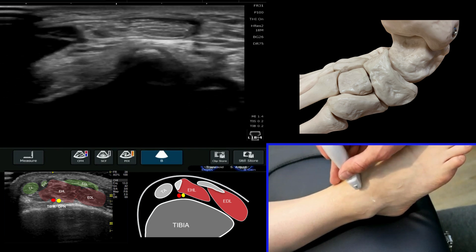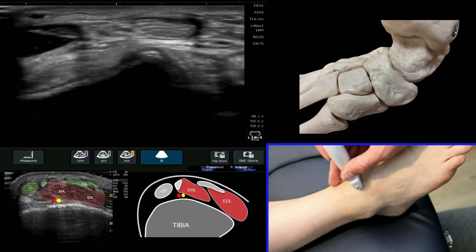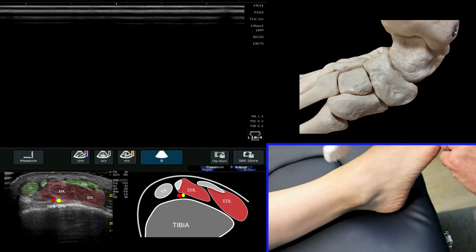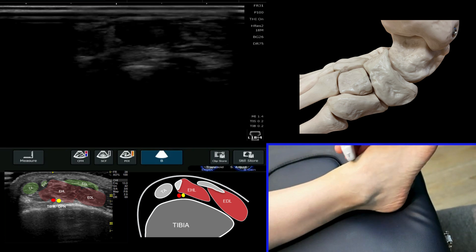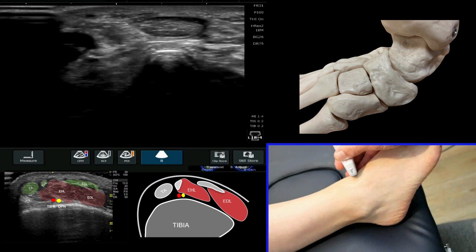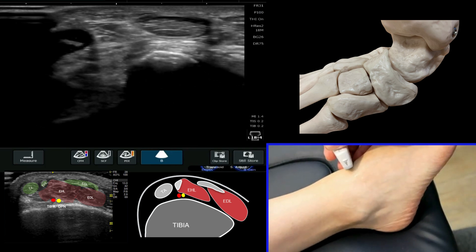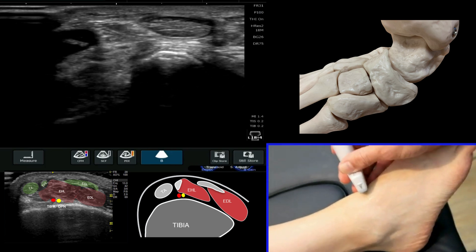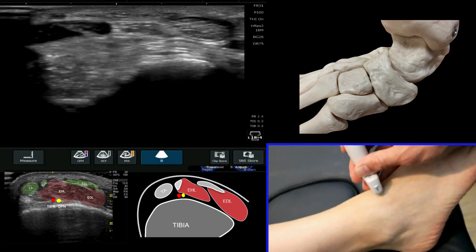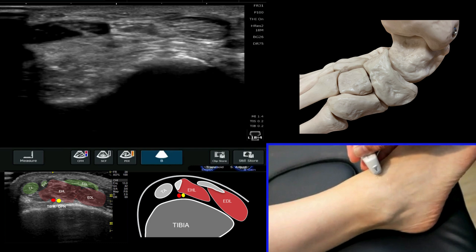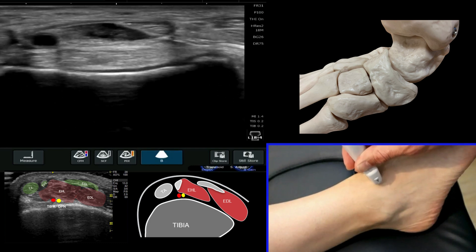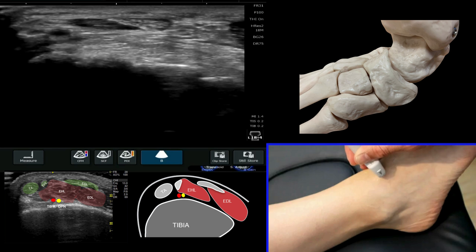If we bring it back up to the ankle joint level and then come a little bit more laterally — getting the patient to roll their foot in so you can see this more clearly — we can start to roll our probe slightly more laterally, and at this point we can start to see the appearance of the EHL, or the extensor hallucis longus tendon.